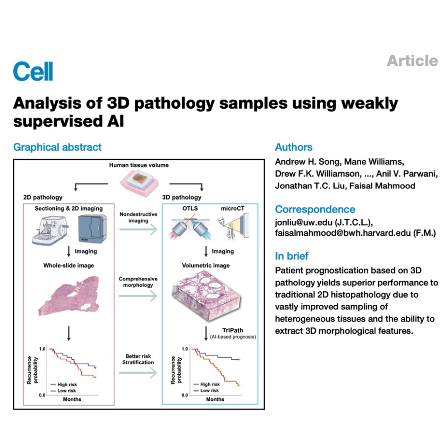Like what? So for the prostate cancer work they describe, the only label TriPath got for each entire 3D sample was, did this patient have biochemical recurrence, meaning did the cancer come back within 5 years? Just a simple yes or no for the whole patient case. Wait, hang on. So you feed it this massive 3D scan and just tell it, this patient's cancer came back or this one's didn't, and that's it. That's pretty much it for the core supervision. It's remarkably minimal. And how does it figure out what in that giant 3D image is related to the cancer coming back? It has to learn somehow.